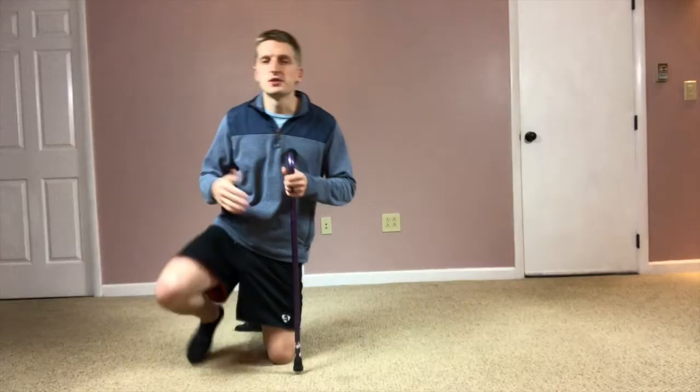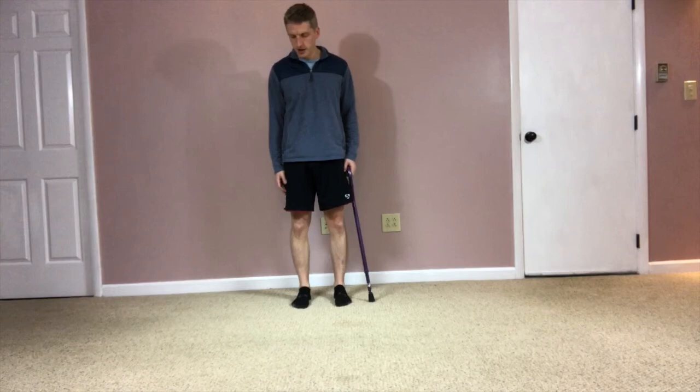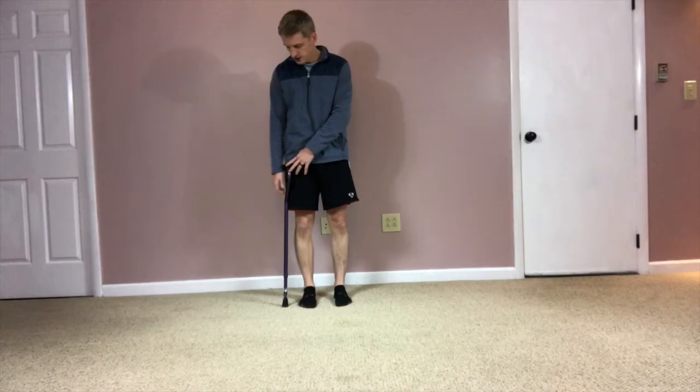So first thing is you want to look at the height of the cane. The way to do that is if you stand in a normal stance and you let your arms relax at your side, the handle of the cane should come right to the crease of your wrist. When you bend and straighten your wrist, that little crease, that's where the handle of the cane should be.